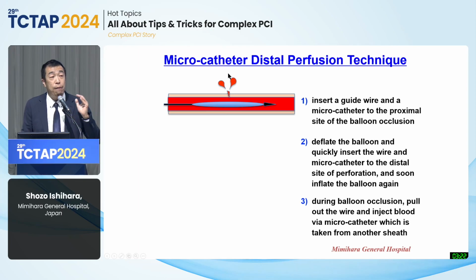First of all, after the perforation, this is not for distal perforation, but it is good for massive perforation.